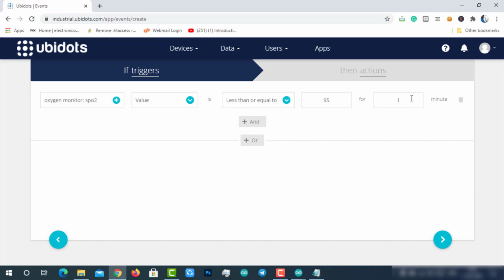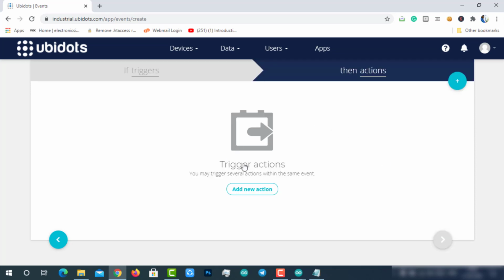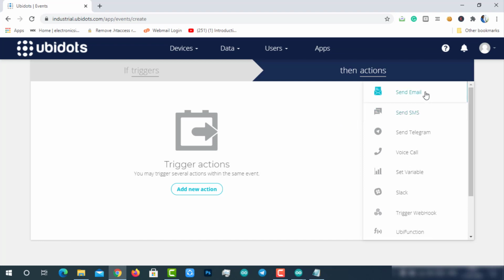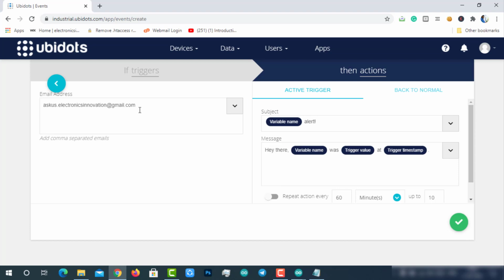logic for the if triggers tab is completed. Select the then action tab to execute the planned event or alert, such as email, SMS, Telegram or voice call. Click on add new action, then select and configure which action is to be executed and the message for the receiver. Available actions include email, SMS, Telegram, voice call, set variable, Slack or webhooks. First of all, I would like to configure email. Enter the email address; we can add two or more emails by simply separating them with a comma. Then type the alert mail subject and message as you wish.